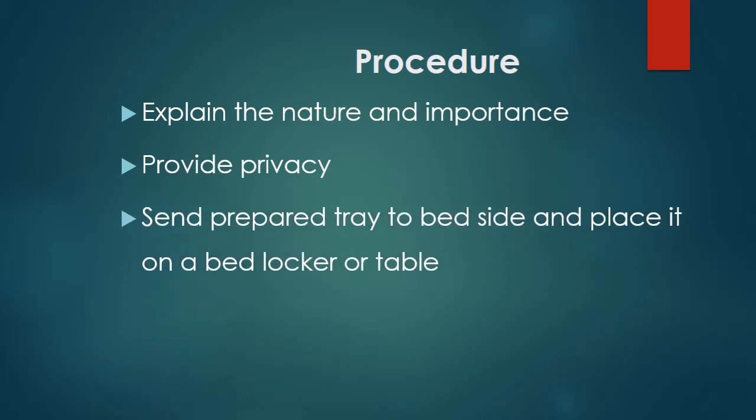Okay, having done this, you would wash your hands and then assemble the needed requirements. And we already mentioned them. We said you need the food, you need a large bore syringe, you need a pH indicator, you have to drape the patient and add something for the patient, or mouthwash basically.